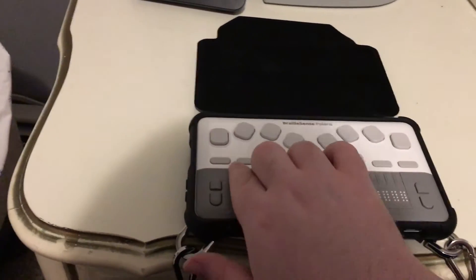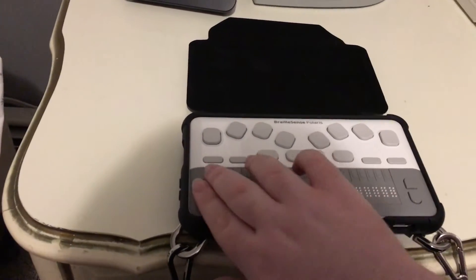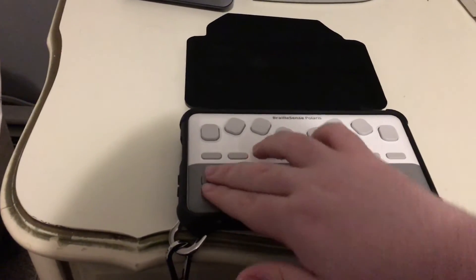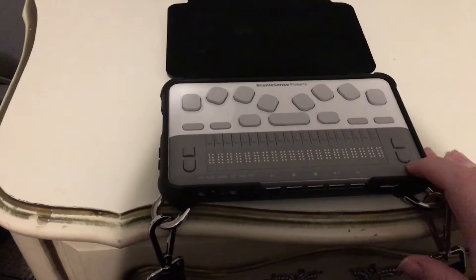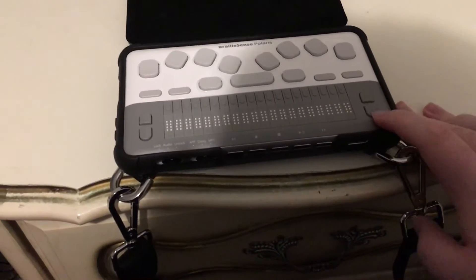Of course, there are your cursor routing keys — 20 of them. And to the left and right of the display, you have scroll buttons, which are certainly easy to find.